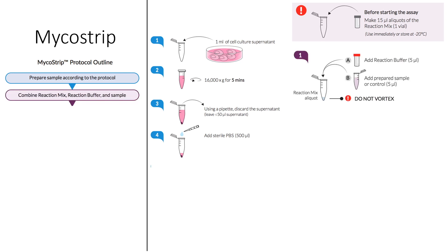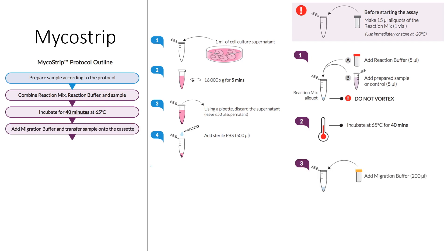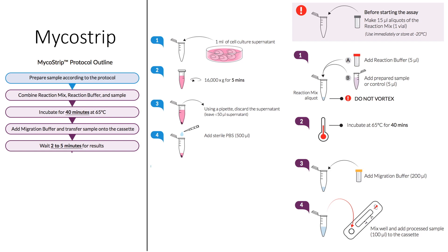Next, combine the reaction buffer and reaction mix to your prepared sample. Please note, do not vortex. Once combined, incubate the mix for 40 minutes at 65 degrees Celsius. Finally, add 200 microlitres of migration buffer to your heated sample. Mix well and add the processed sample, approximately 100 microlitres, to the cassette. Then wait 2 to 5 minutes for the results.